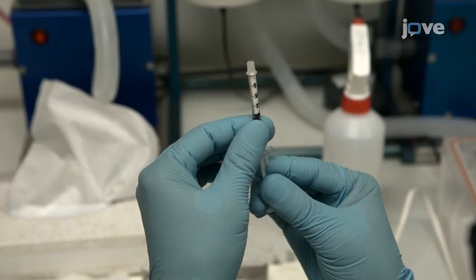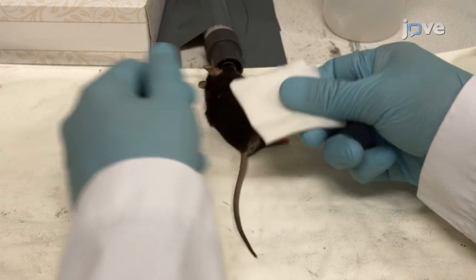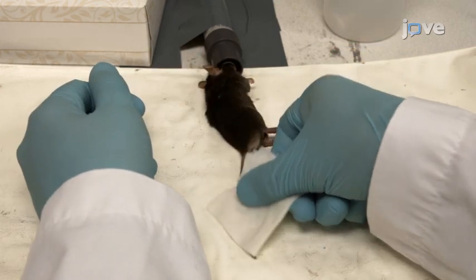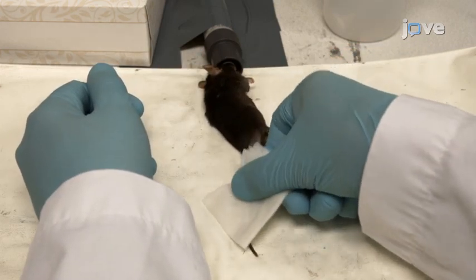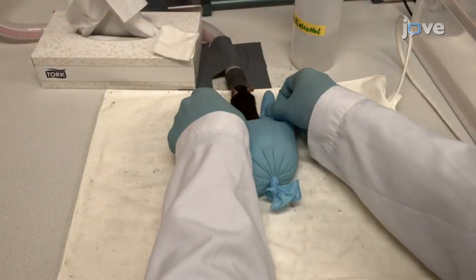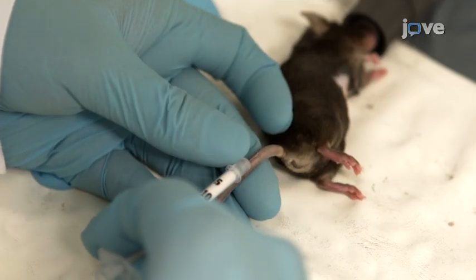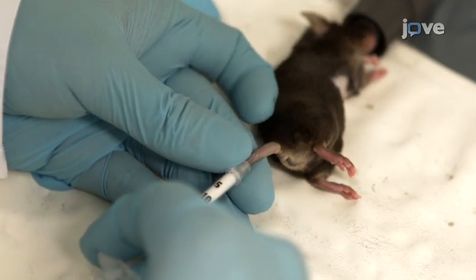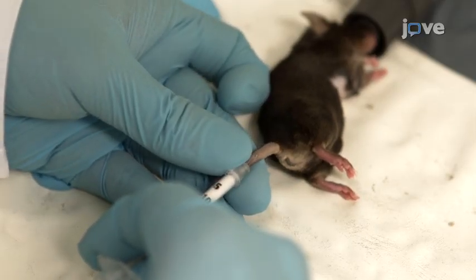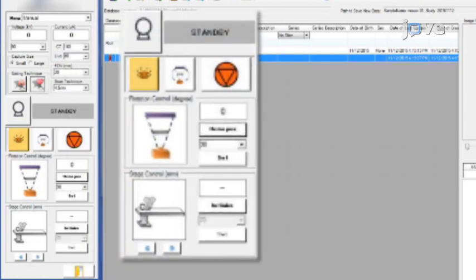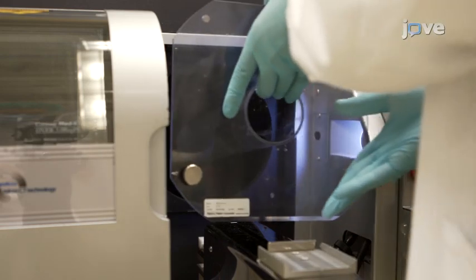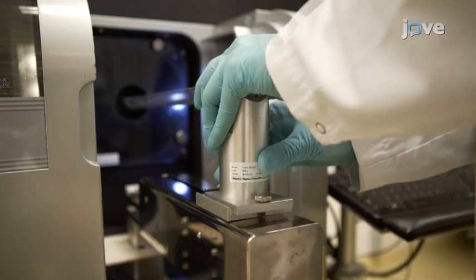After purging the air bubbles, swab the tail of the anesthetized mouse with 70% alcohol and heat dilate the tail veins. Inject the contrast agent into a lateral tail vein. When the Live Mode button appears in the control software, the x-ray tube is ready. Insert the small bore cover and the small animal bed.